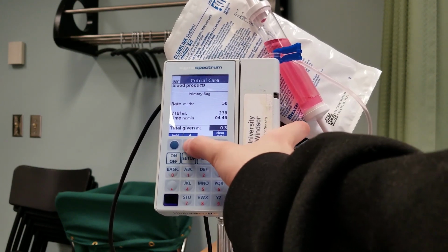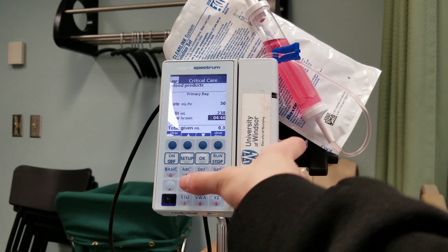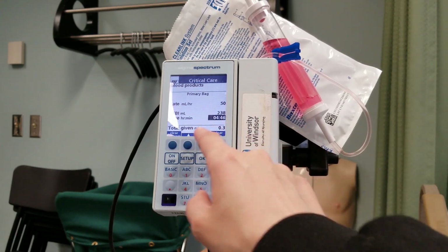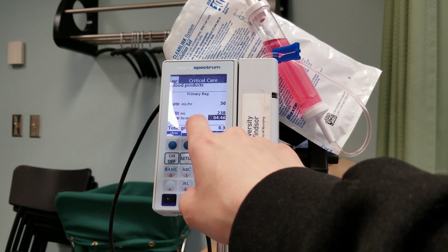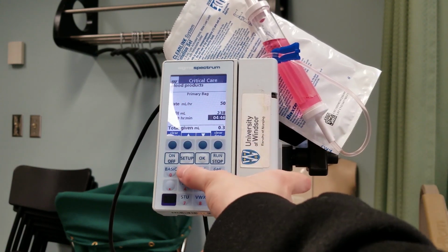And then I'm going to go back up, and I'm going to adjust my time. We already did the 15 minutes, so now we only have an hour and 45 minutes left. So now I want to put 1 hour and 45 minutes. Note that this isn't fully an hour, so I'm not putting 1.75. I'm putting 1 hour and 45 minutes.